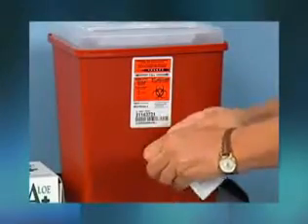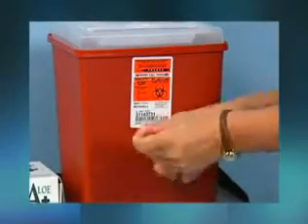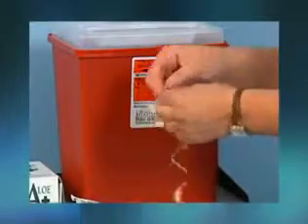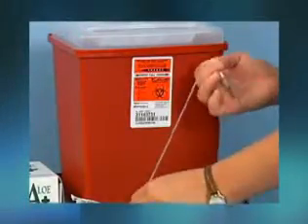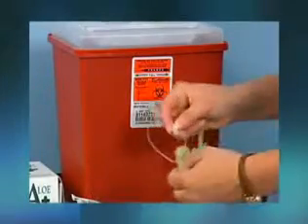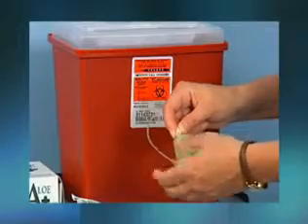The butterfly method of vena puncture is also called the winged infusion method. This is because a winged infusion set is used to collect the specimen. The term butterfly is derived from the plastic wings located between the needle and tubing of the winged infusion set.